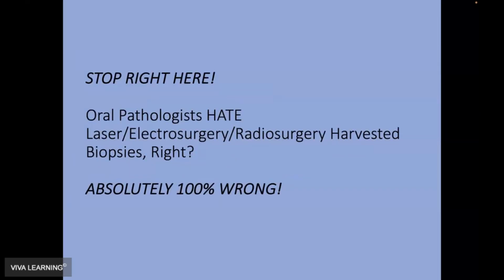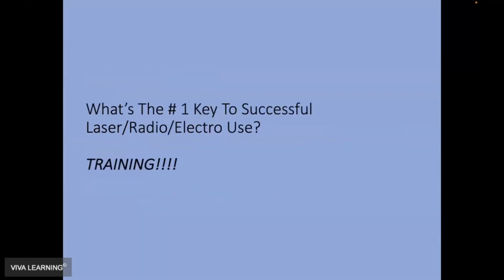Oral pathologists hate laser biopsies and electrosurgery biopsies and radiosurgery biopsies, right? No, that's not right at all. That's 100% wrong. What's the number one key to successful laser or radiosurgery or electrosurgery use when performing a biopsy? Training. If you know how to use the device, you will have no effect whatsoever on the biopsy specimen.